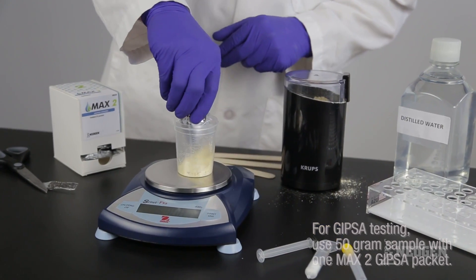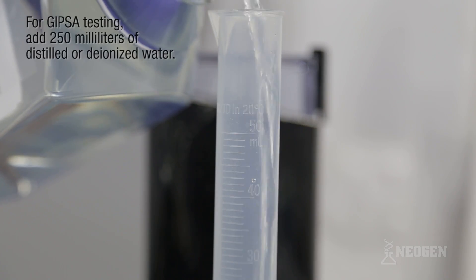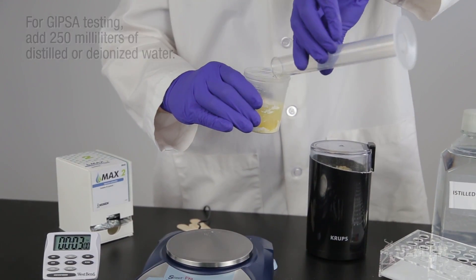Pour the contents of one Max 2 aqueous extraction packet into the sample cup. Add 50 milliliters of distilled or deionized water into the sample cup.